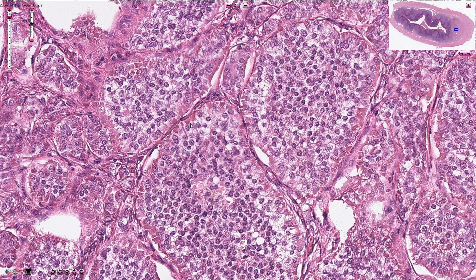On the periphery of the solid nests we can see palisading of the cells, and in between the solid nests we can see fibrovascular septa.